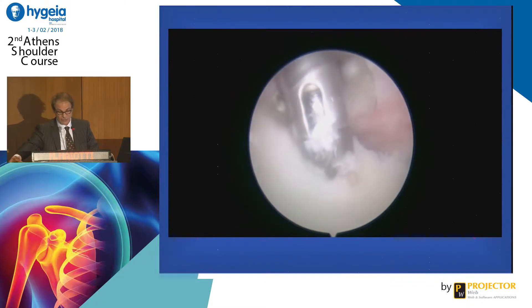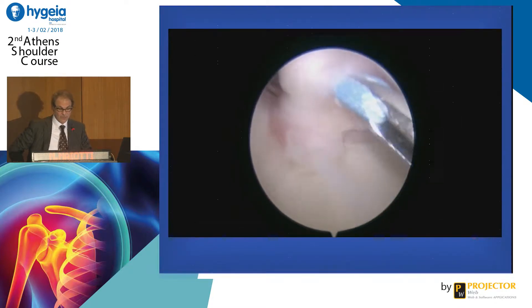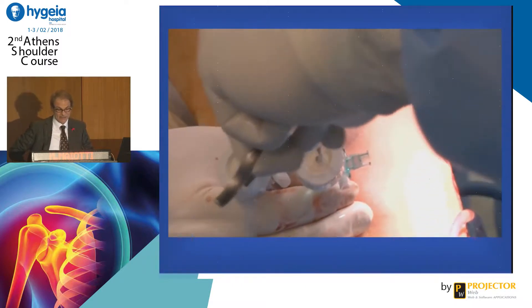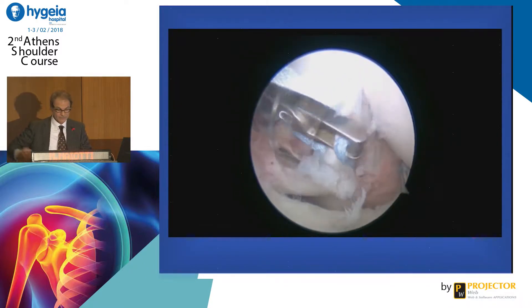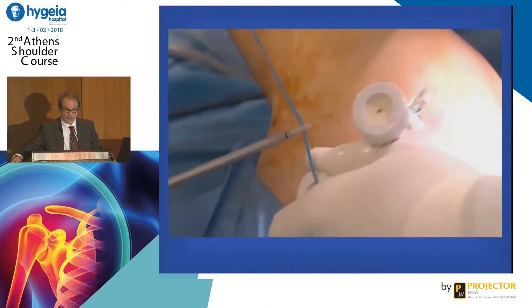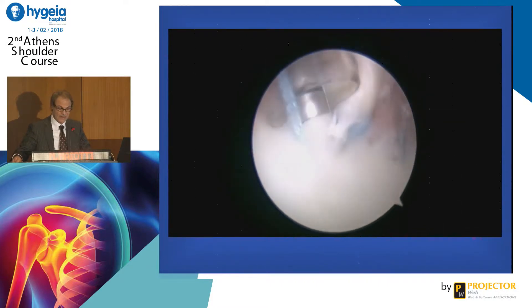You do the anchor bone hole at 3 or 2 o'clock — here it is 9 or 10 o'clock. You expose a little bit the subscapularis if you want, cutting the middle glenohumeral ligament. You penetrate the tendon with the tape — here we are using an ultra tape, but we have used fiber tape and labral tape. Then we pass the tape from the upper cannula, retrieve it from the lower cannula, and make a loop. You slide the loop over the tendon, and then put the end of the tape in the area of the anchor. You slide the anchor to the bone hole, taking care that the two ends of the tape are parallel, and then you impact.